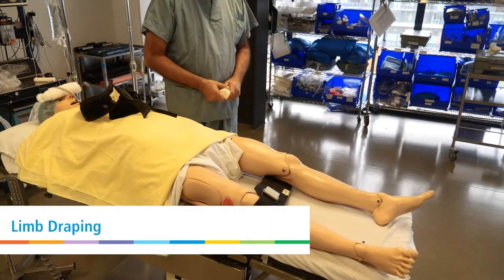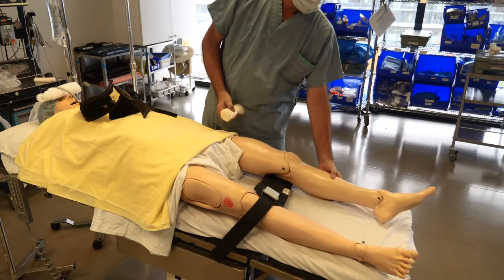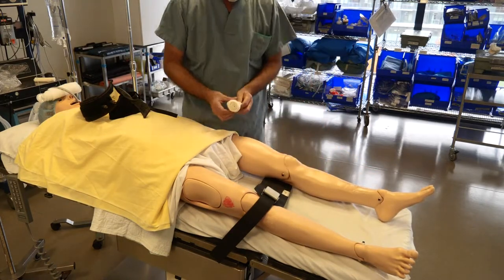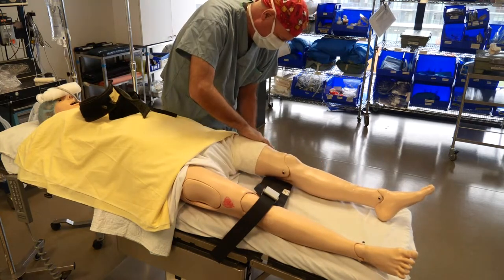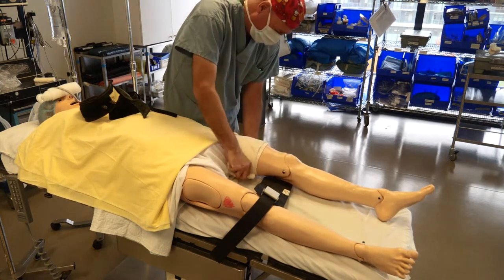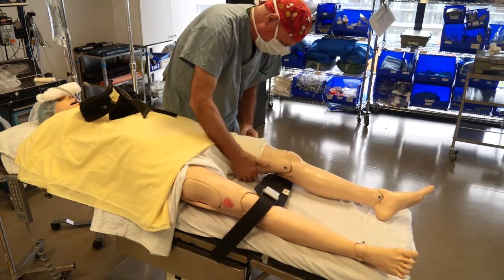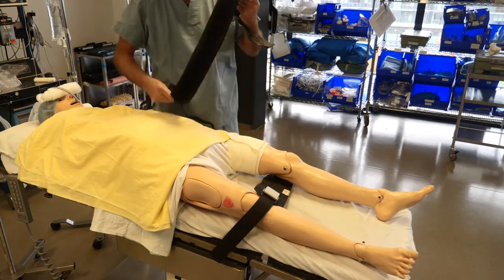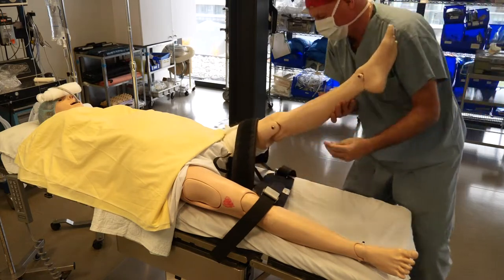This video will demonstrate how a limb will be draped for surgery. Here we have a patient who's been marked for a left knee arthroscopy. We have the circulating nurse applying a soft material around the patient's left thigh. This can also be performed by a designate such as a resident or the staff surgeon himself, but here we have a circulating nurse.